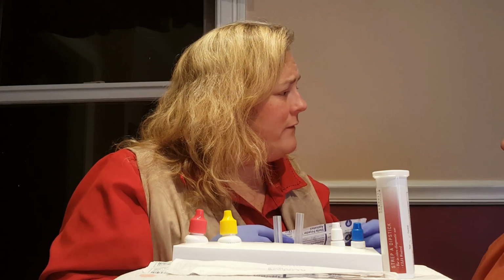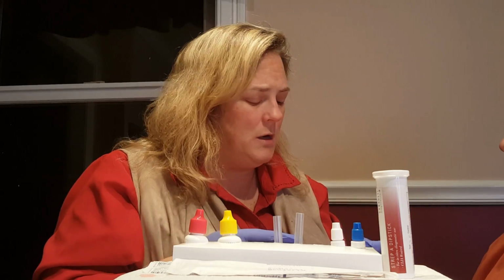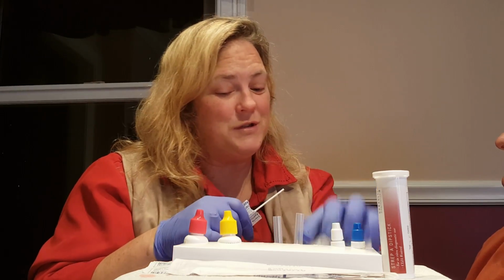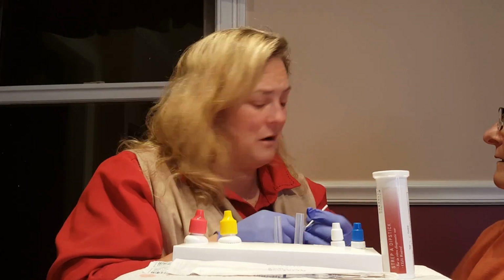So today we're going to perform a strep test. I'm understanding that you are having some sore throat, some pain in your throat, so we want to collect a sample to check for strep. Okay. What I'm going to need you to do is to open your mouth wide, stick out your tongue, and just say the word ah, and that will help me see your tonsils. It's important that you stay still and not move during the procedure. You may feel a little tickle in the back of your throat when I do this, and I'll be very quick. As long as you stay very still during this procedure, I won't have to repeat it.